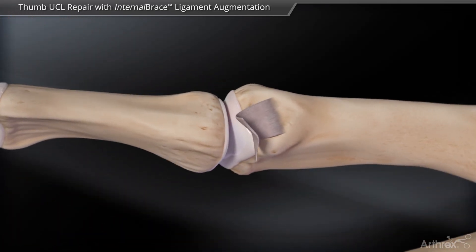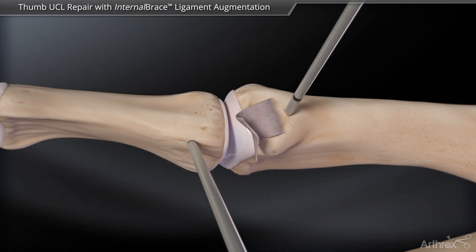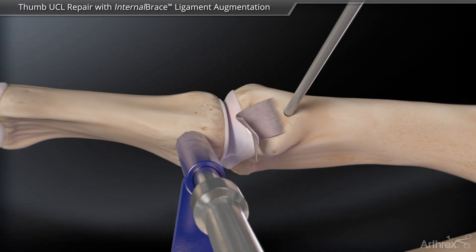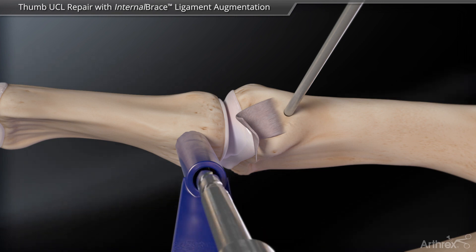Place a guide wire up to the laser line into the proximal phalanx. A second guide wire is placed just proximal to the origin of the UCL on the metacarpal. Overdrill both guide wires with a 3 mm cannulated drill bit and drill guide.